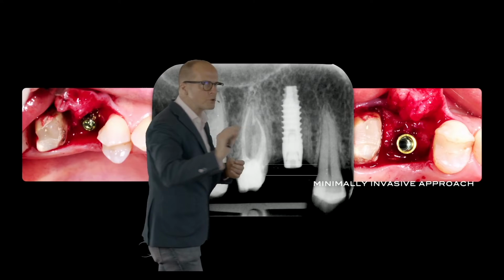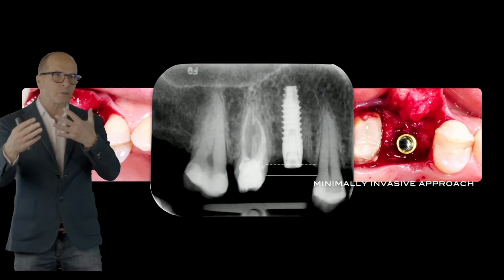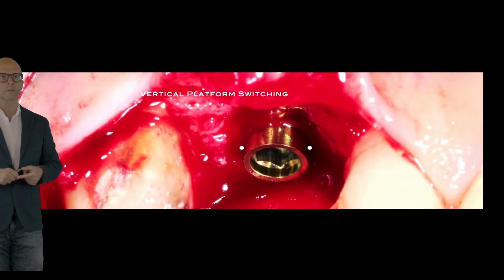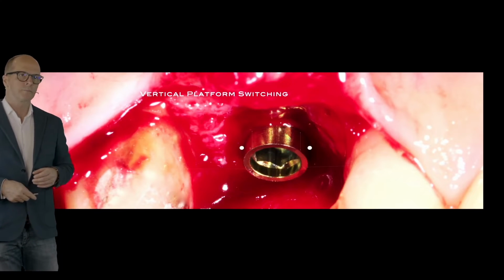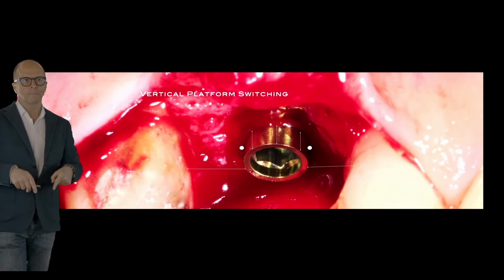I don't have to push my implant deep inside the bone. And then I have part of the neck which is exposed, and there I get the biologic seal. So, in a way, I have the vertical platform switching. The micro gap is far from the bone. That means crestal bone stability.